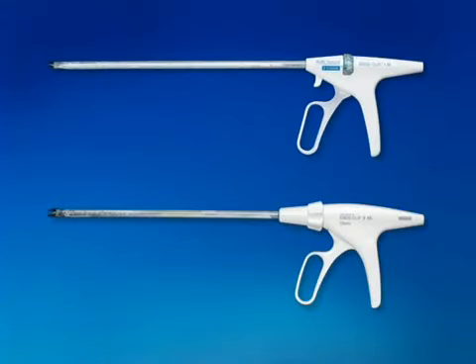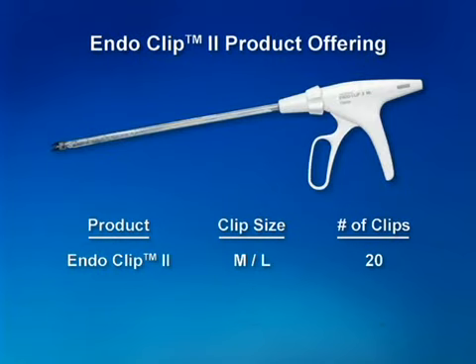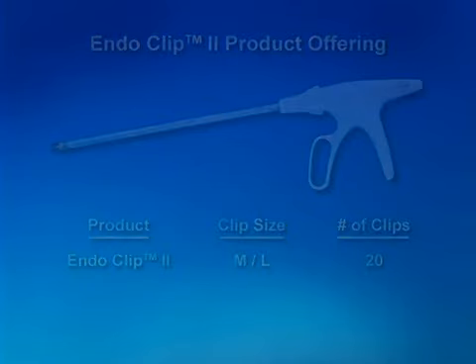The EndoClip and EndoClip 2 clip appliers are packaged individually in blister packs. The EndoClip comes in three clip sizes: medium, medium large, and large. The medium and medium large have 20 clips per instrument. The large has 15 clips per instrument. The EndoClip 2 comes in one clip size, medium large, with 20 clips per instrument.